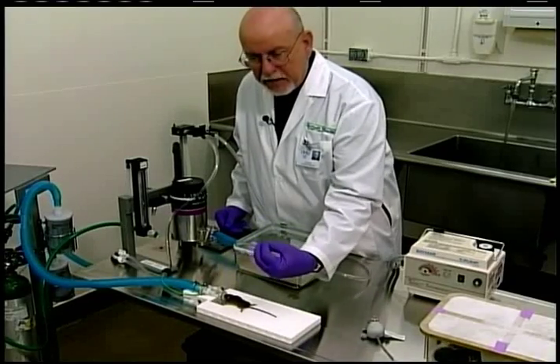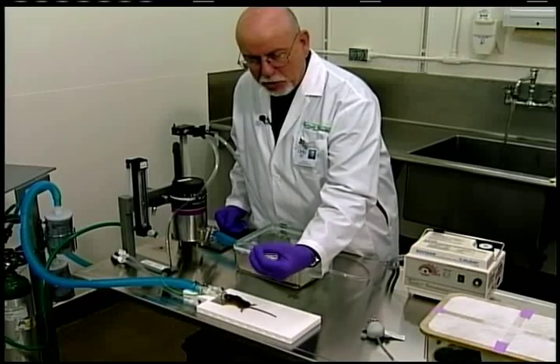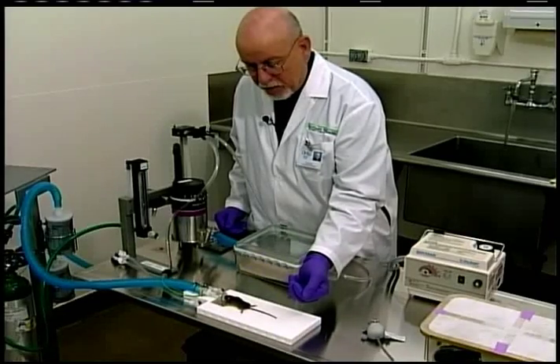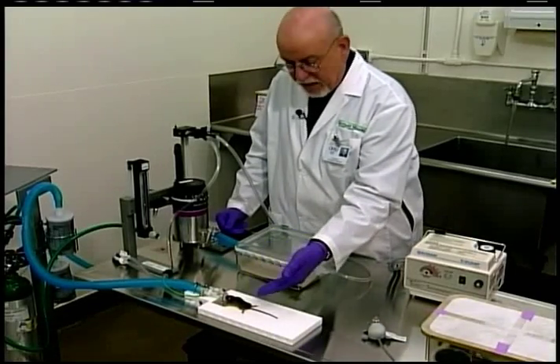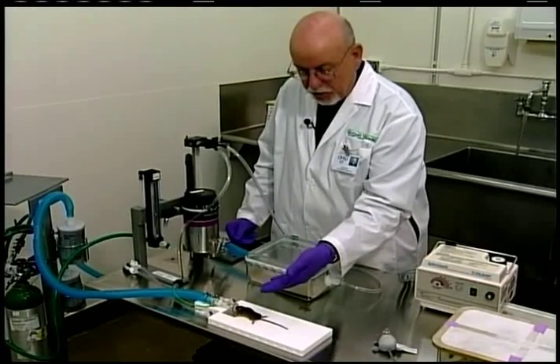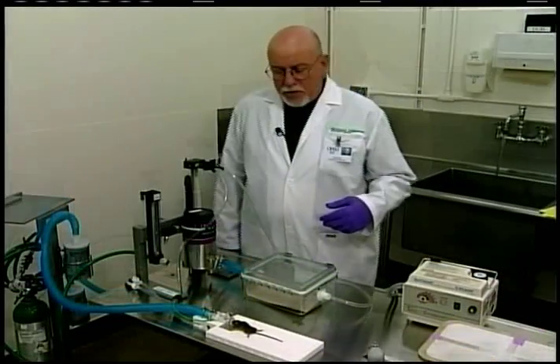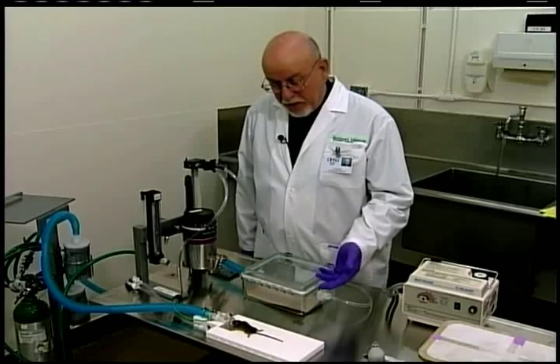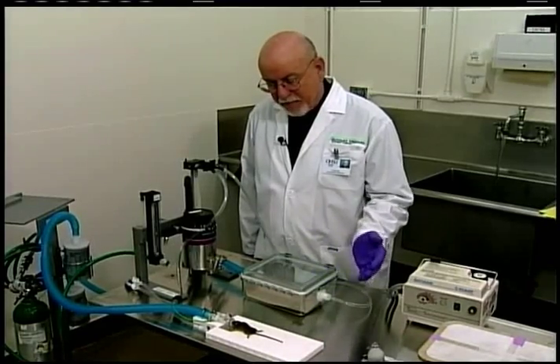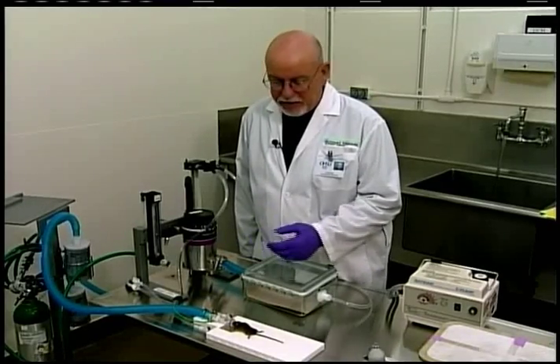If they mouth breathe and their mouth is outside the nose cone of the face mask, then there's a tendency for them to draw in room air and dilute down the concentration of anesthetic, and they'll have a tendency to wake up on you. So here we have, at this 2.5% concentration, a fully, completely anesthetized animal in which you can do whatever surgical procedure you wish to do on them. So we were able to anesthetize our little friend here, and as you notice, we could bring him from the ambulatory state to the surgical plane of anesthesia in approximately 2 minutes.